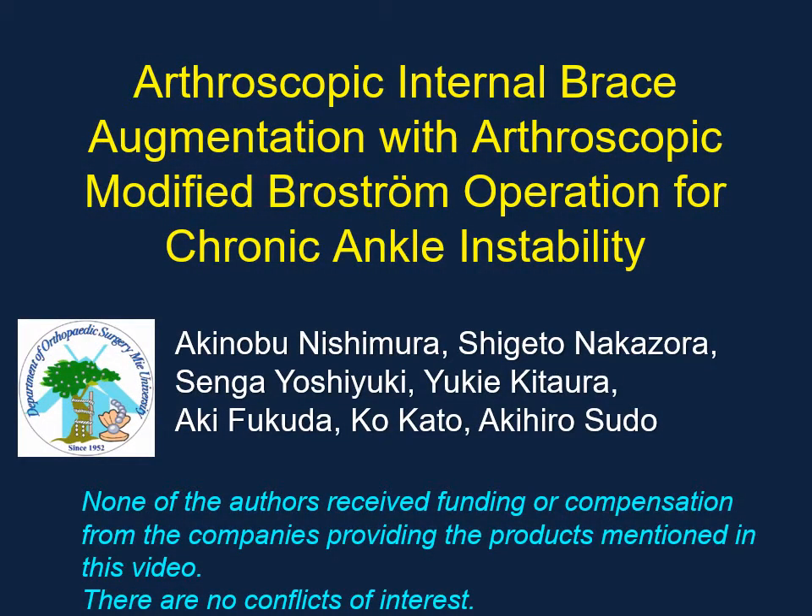In this video, we present arthroscopic internal brace augmentation with the arthroscopic modified Broström operation for chronic ankle instability.